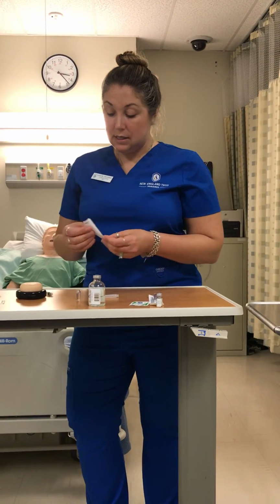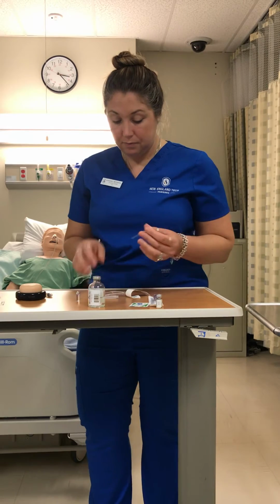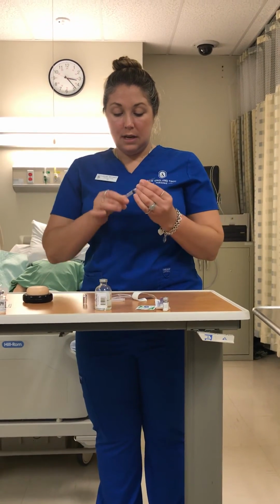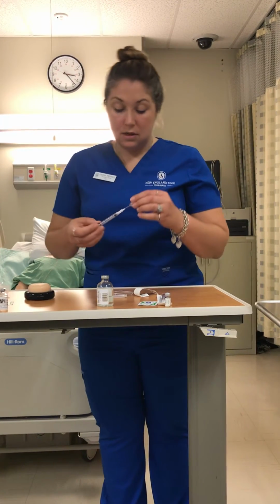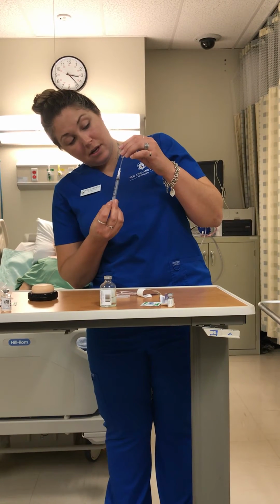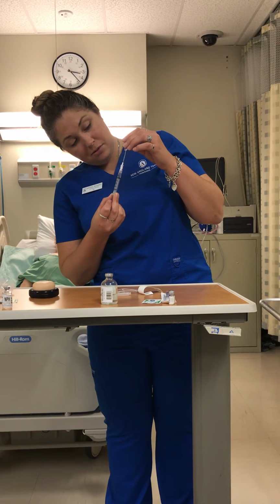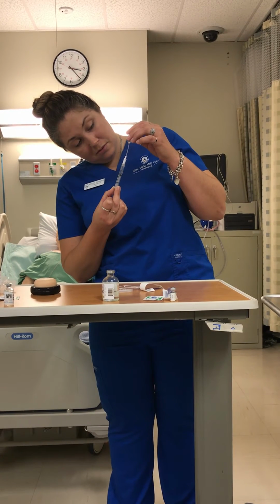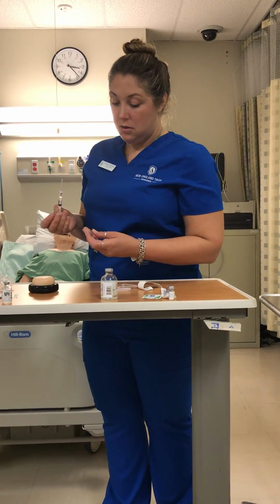And then, because this was in a glass container, you need to use a filtering straw needle. It's flexible, it's a plastic, it has a filter inside. You're going to attach that to your medication, to your plunger and needle, and you're going to stick it in, and then you can tip this medication upside down because it's vacuum sealed, and you just want to suck out the medication. Being sure not to break that seal. And that would go into a sharps container.